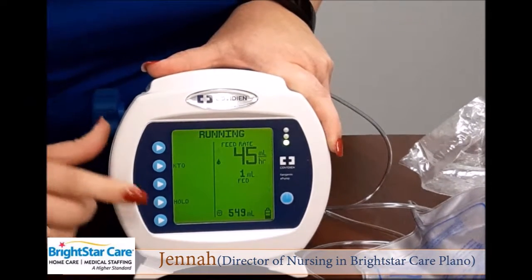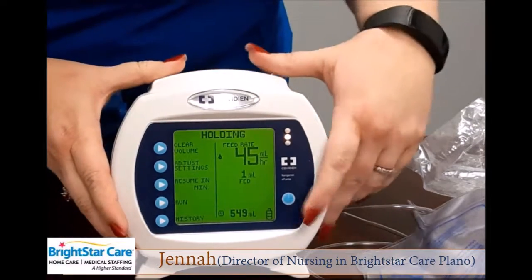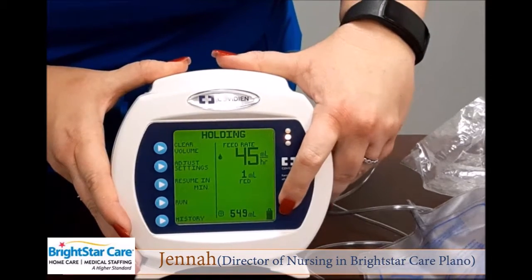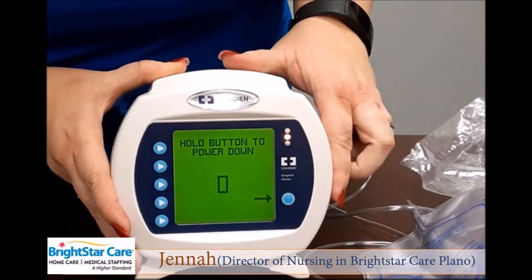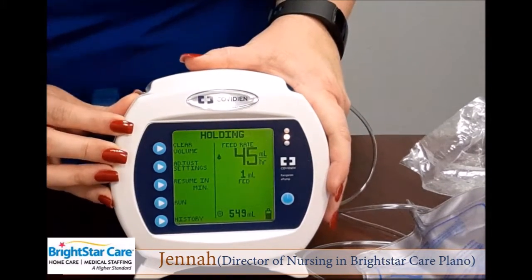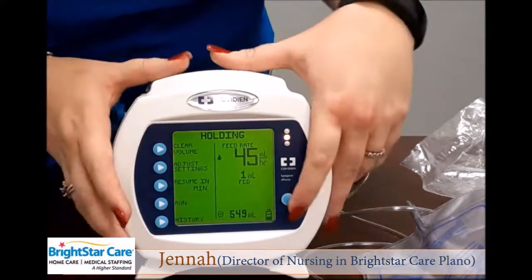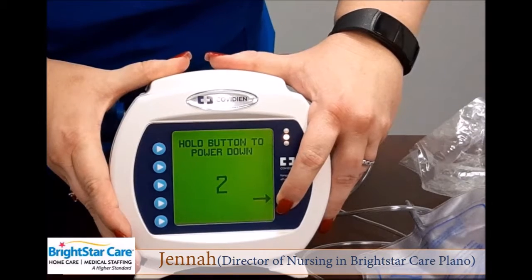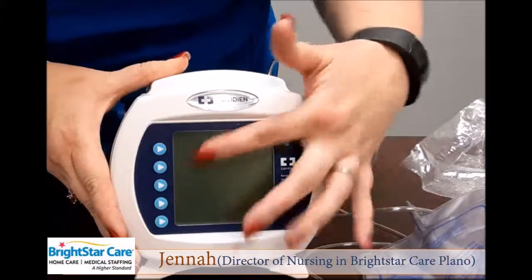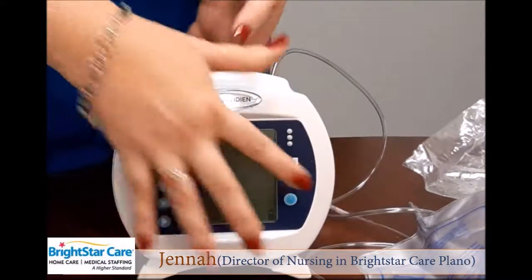Now, to power off my pump, I'll stop it from running, and then you're going to hold down your power button. There is a trick to this. If you hold down your power button, but you don't hold it through the entire countdown, it's going to reset directly back to the screen that you were on, just in case you accidentally bumped it and didn't mean to turn it off. You actually have to hold down through the entire countdown sequence in order for your pump to then power off, where all your screen will go black and your lights will go dark. At this point in time, your pump is powered off.